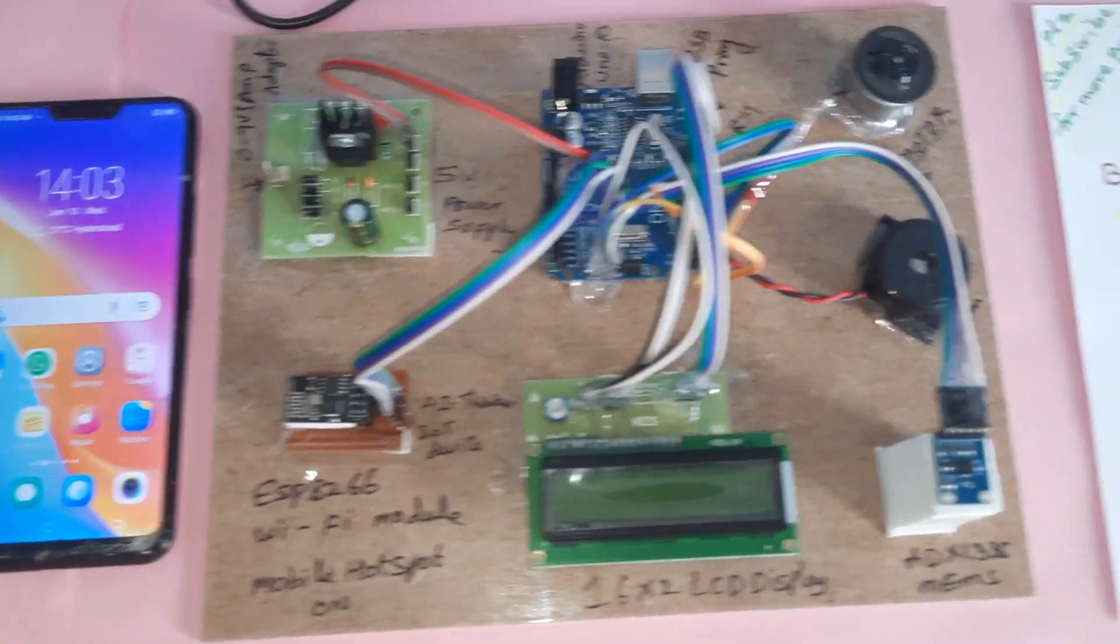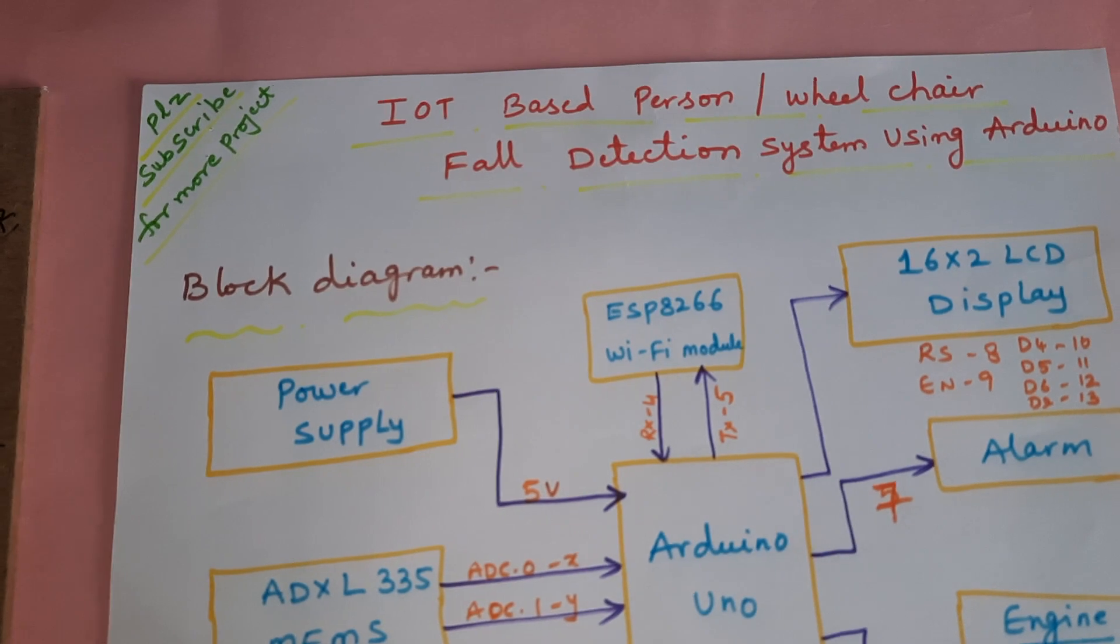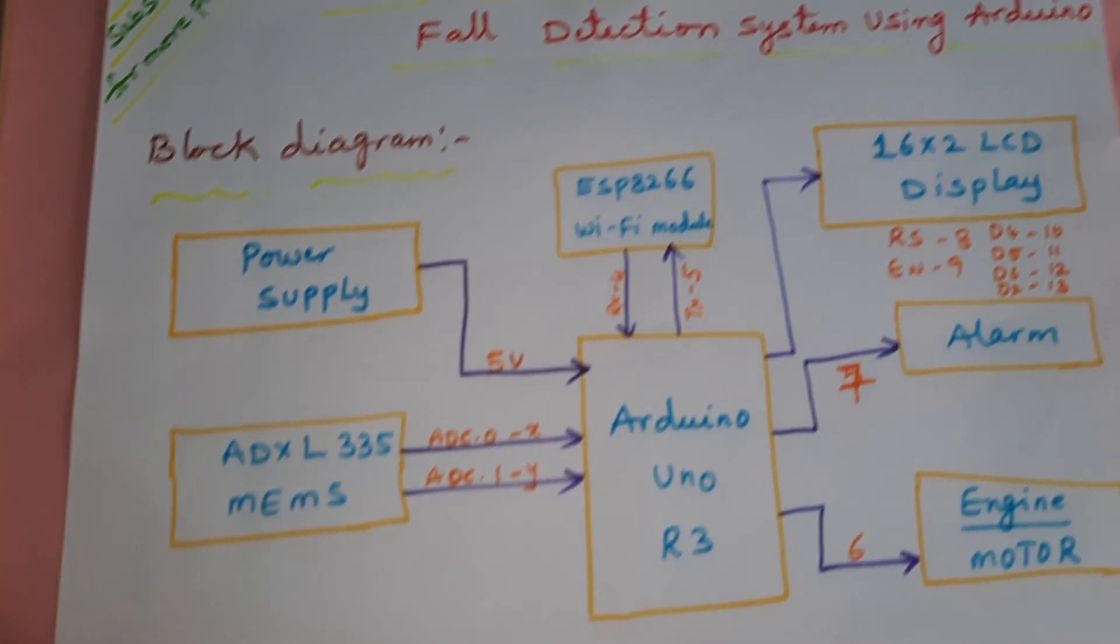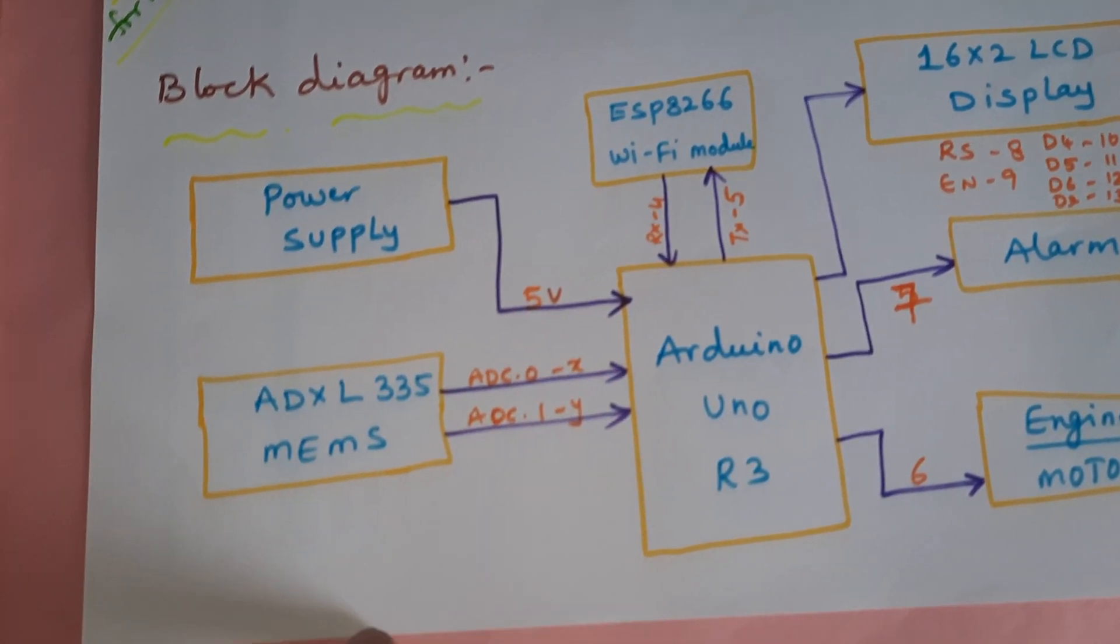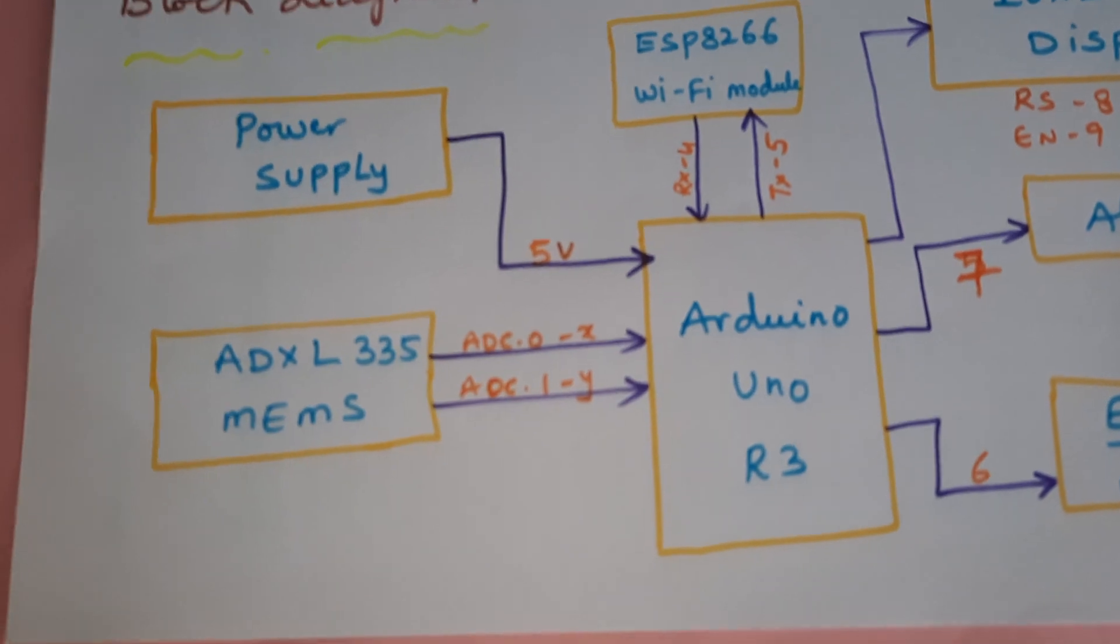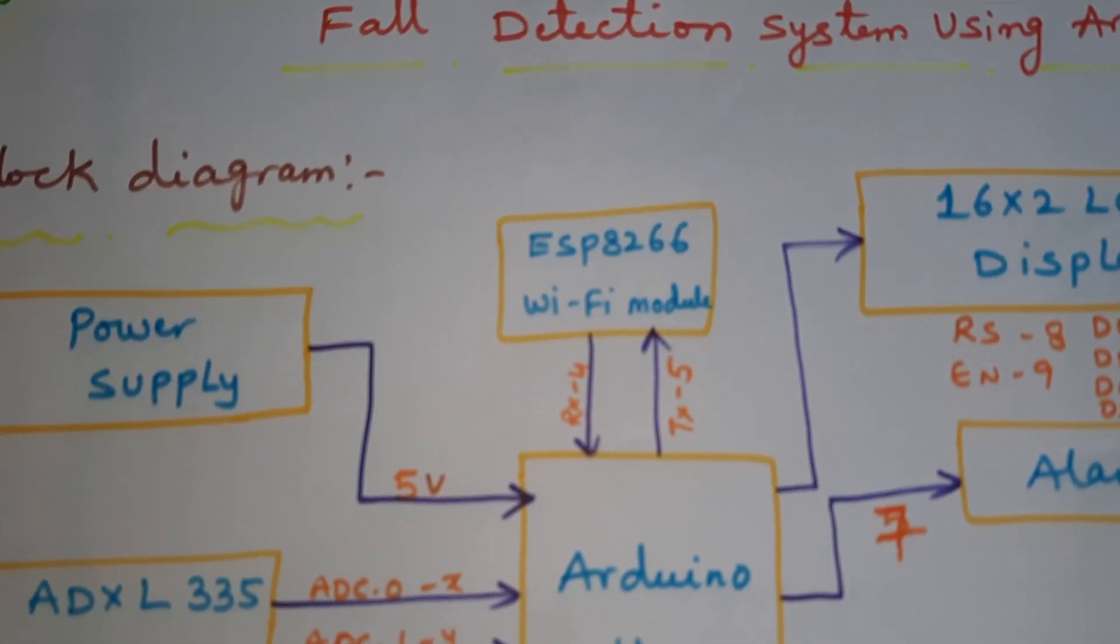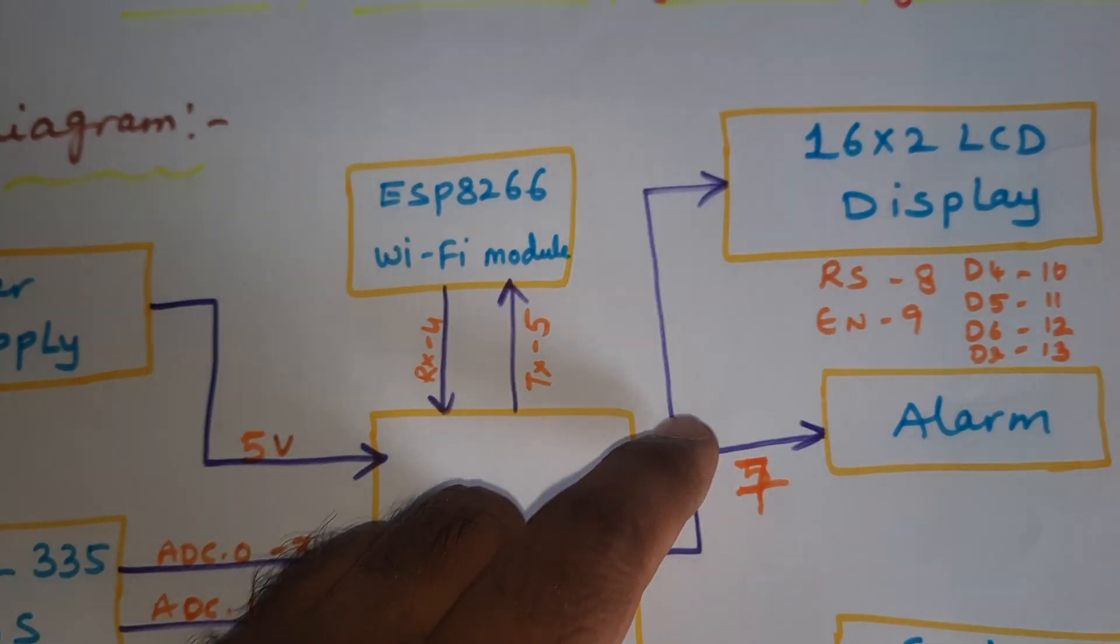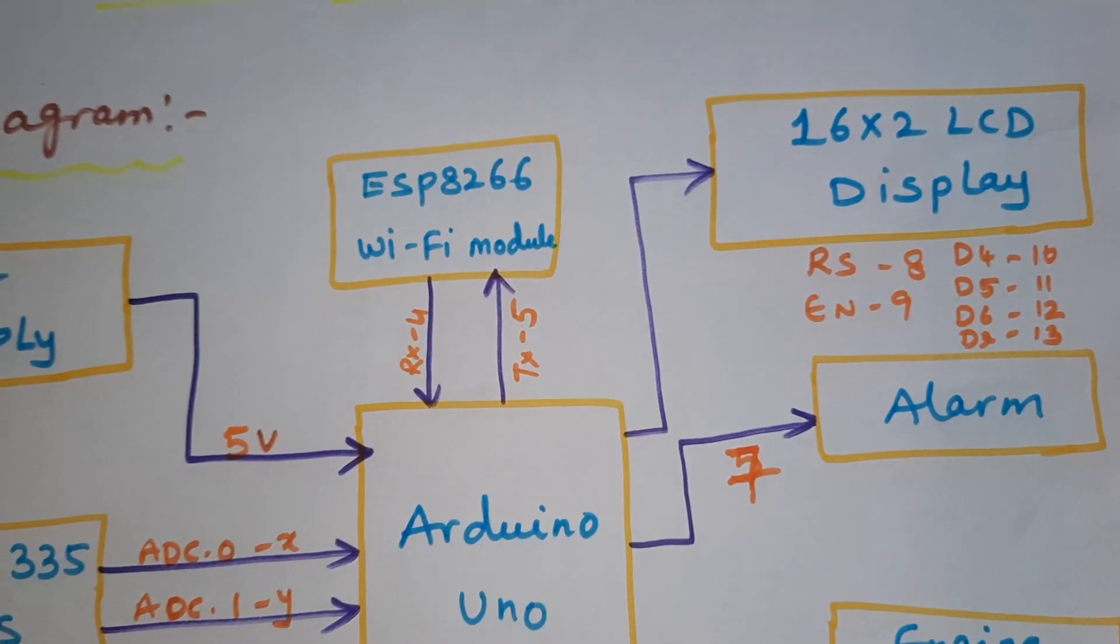Hi, the project title is IoT based person wheelchair fall detection system using Arduino. In this project we are using a 5 volt power supply module, one Arduino Uno R3 board, ADXL 335 MEMS accelerometer, ESP8266 WiFi module, and one 16x2 LCD display. The RS, enable, D4, D5, D6, D7 pins are connected.